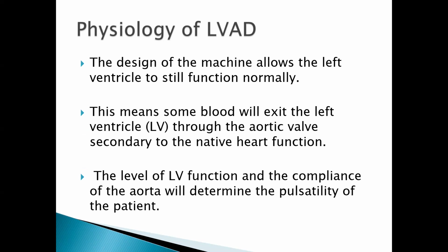We all know that the left ventricle is the biggest, and in cardiology it's where almost everybody always focuses. So we'll be talking more about the left ventricular assist device. This device allows the left ventricle to function normally. It's positioned outside the heart, and its major job is to help blood flow to maintain circulation in a patient's failing heart.